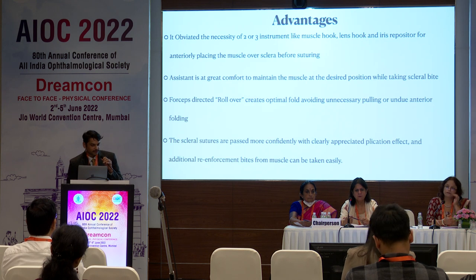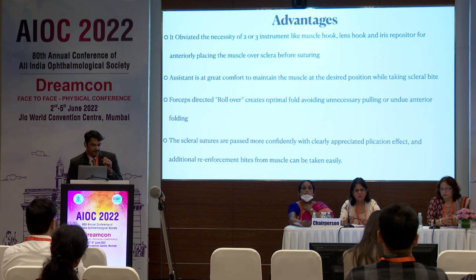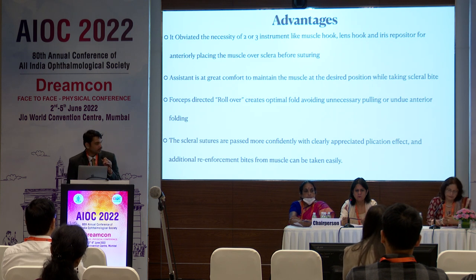And the assistant also felt great comfort while maintaining the muscle position before taking the final scleral bites. And the forceps directed rollover creates an optimal fold, avoiding unnecessary pulling or undue anterior folding. The scleral sutures are also passed more confidently with clearly appreciated plication effect. And additional reinforcement bites can also be taken from the muscle.